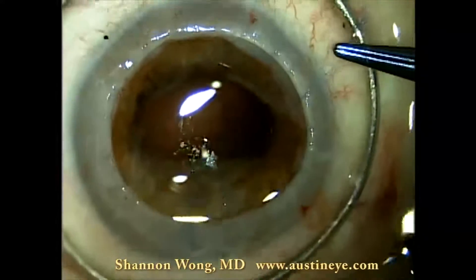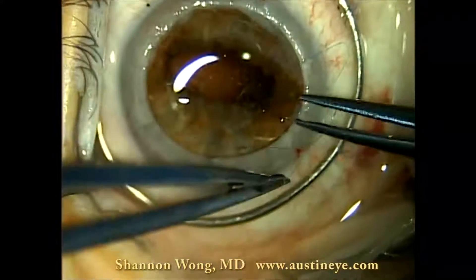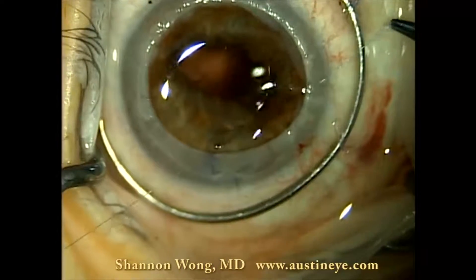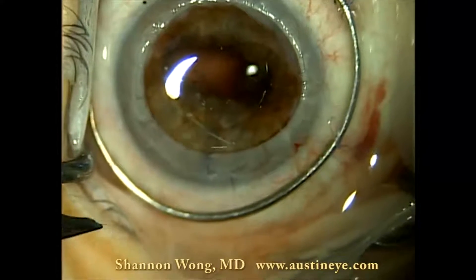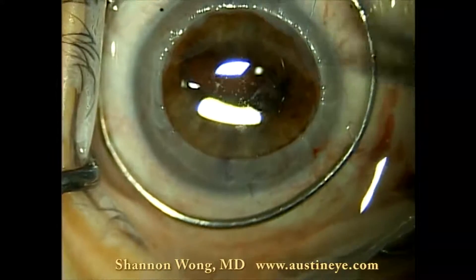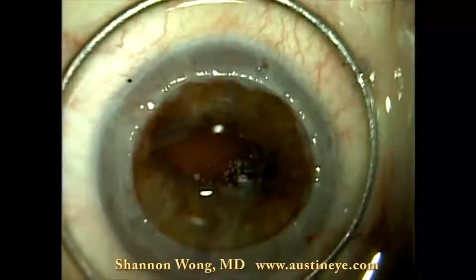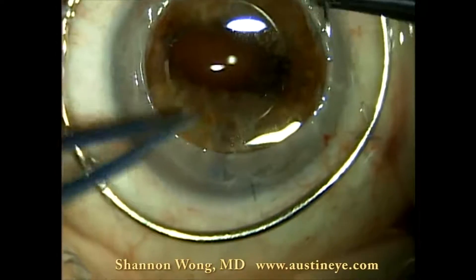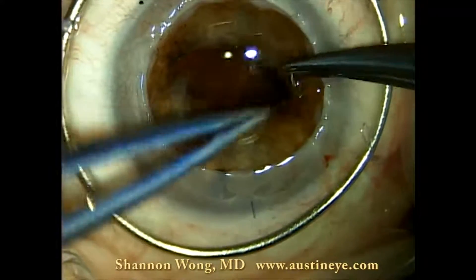Now we have the optic anterior to the iris plane and we tighten the suture. We use the same Prolene material to fixate each haptic of this lens implant to the iris — just two throws, one for each haptic.